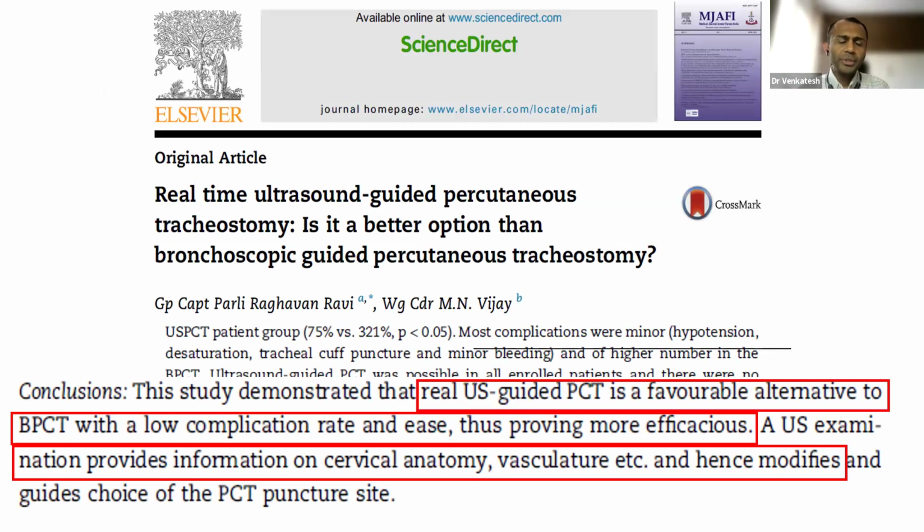This study clearly demonstrated that real-time ultrasound guided percutaneous tracheostomy, with a lower complication rate, helps us understand the cervical anatomy and vasculature, and hence the way you choose the puncture site can be modified.